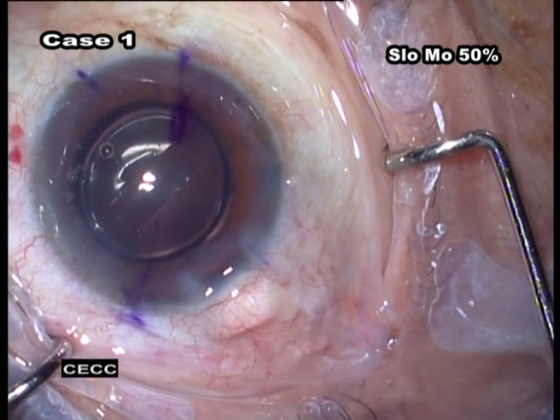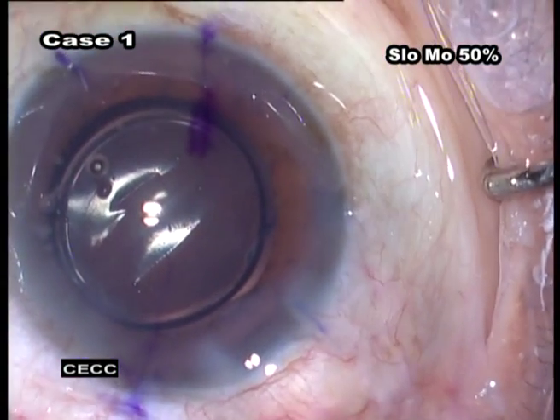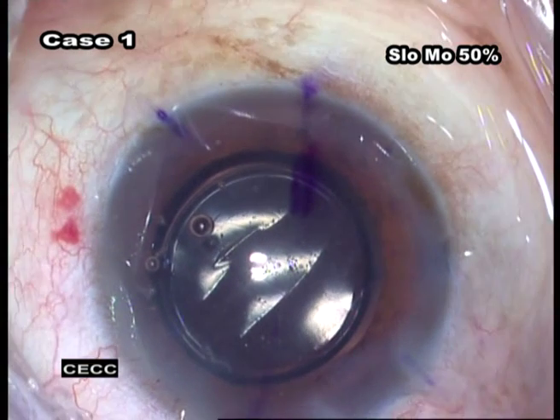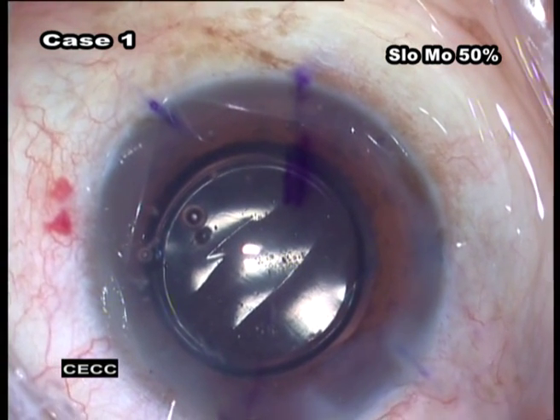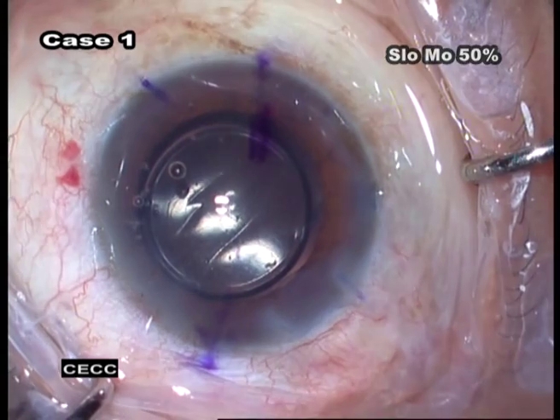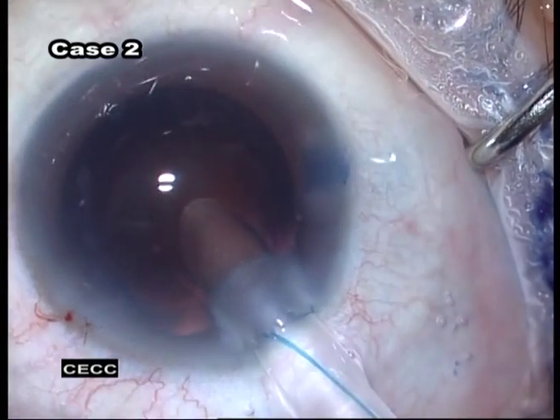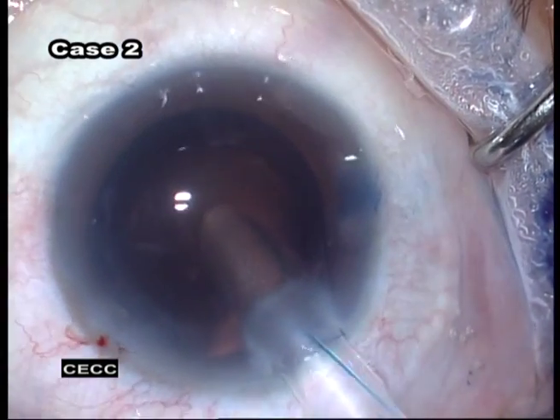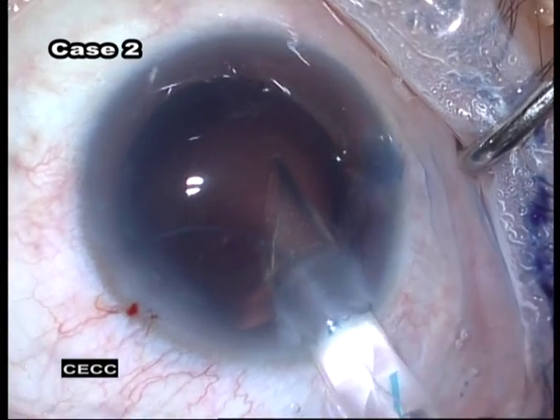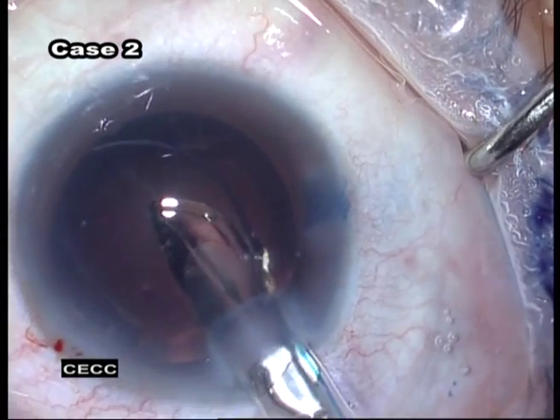Also, if the leading haptic tip is not pointed to the left after rotation, the IOL may flip after it is released from the tube of the cartridge. If the haptic is not pointing to the left as the haptic exits the cartridge, remove hand from the screw mechanism and rotate the handpiece body with the cartridge until the haptic is pointed to the left. Once the haptic is pointed to the left, rotate the screw mechanism and the handpiece body as necessary until the optic body is fully released into the capsular bag.